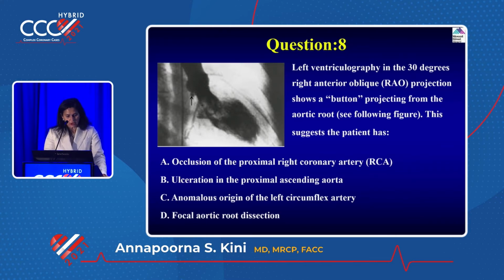This comes up in the cardiology boards. They can give you a picture like this, or they can show angiograms, videos. When you see it, you'll see the circumflex going behind. So remember that. And of course, what they'll do is they can change the question.